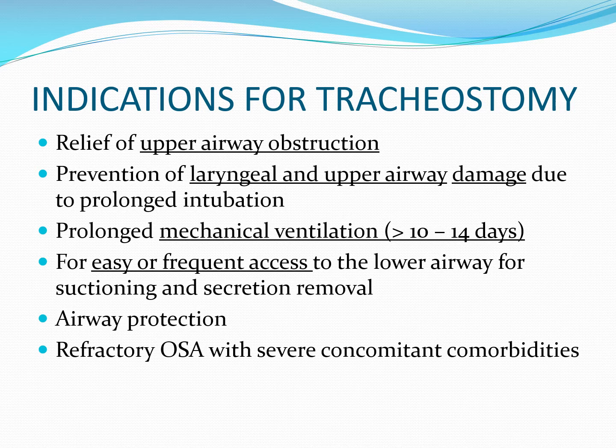So what will often happen for patients who are on mechanical ventilation and have an endotracheal tube in place at about day 10 or 12 or so, the discussion will ensue. Gee, is this patient, can they be liberated in the next few days? Have they failed prior attempts? And if the prognosis for them coming off the ventilator at, again, day 10 or 12 is not imminent, it doesn't look like it's going to happen in the next 1 or 2 or 3 days, then the patient will probably likely be a candidate for a tracheostomy tube.